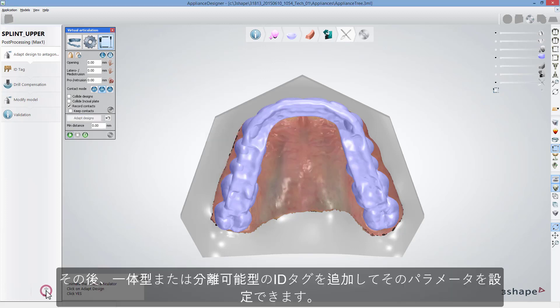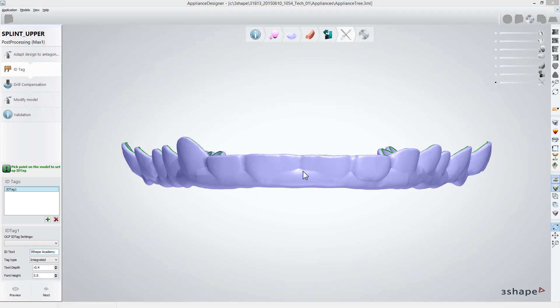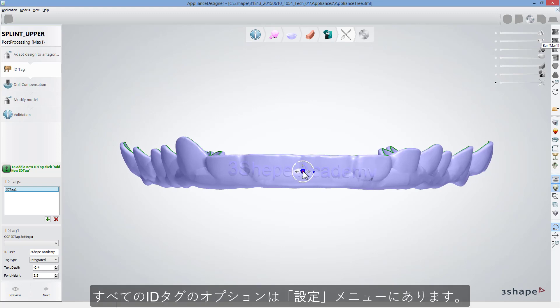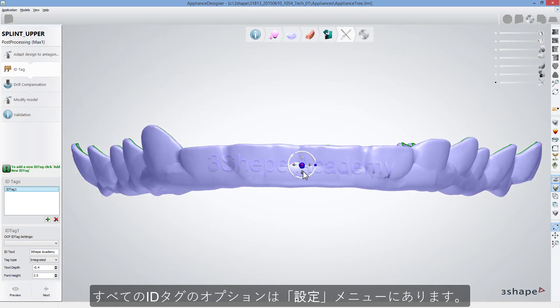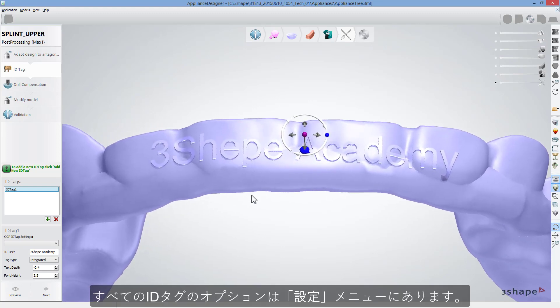After that, you can add integrated or detachable ID tag and set all its parameters. All ID tag options are available in the Settings menu.